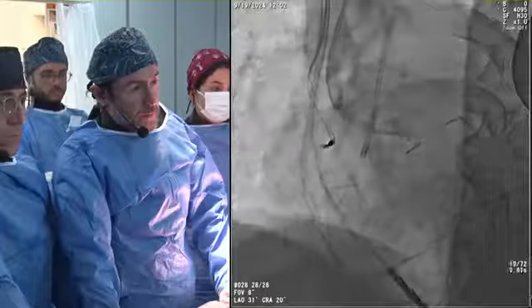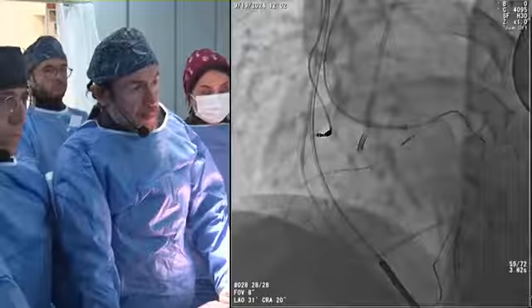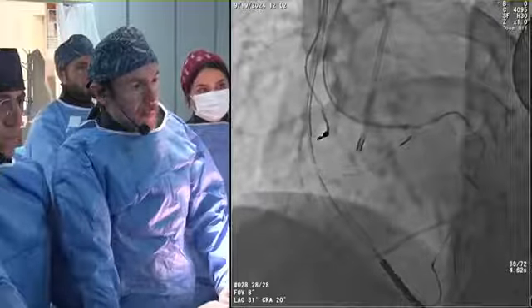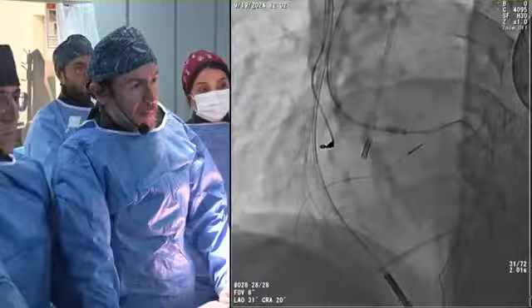So now we are in the aorta, and we made a tip injection from here to be sure where we are. And we think we are in the aorta. What do you think? We have blood coming and the blood is red, but it can still be the PA. If you go LAO and it's posterior, that means you are in the aorta. You can confirm that. And in RAO, the PA is always anterior to the aorta. So you just take an LAO and RAO, and that will tell you.